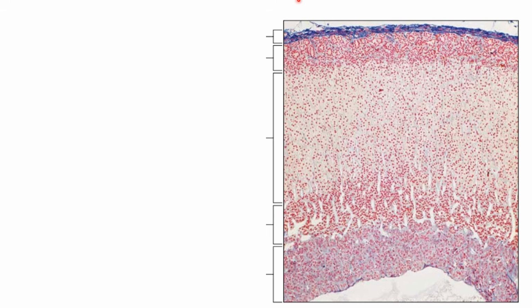What we're looking at here, this is the adrenal gland. The adrenal gland, remember the posterior pituitary, or not the posterior pituitary, the whole pituitary had two very distinct layers. The adrenal gland also has layers, but it has more layers. It's not just two, and sometimes they're also a gentler gradient. This one is pretty distinct, but sometimes this middle layer oftentimes blends right into the lower layers, right into the upper layer. It's hard to pick them apart.